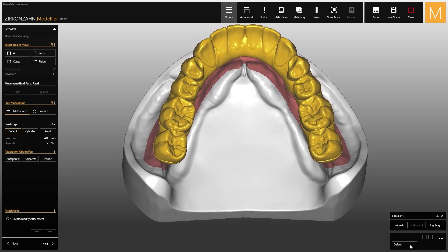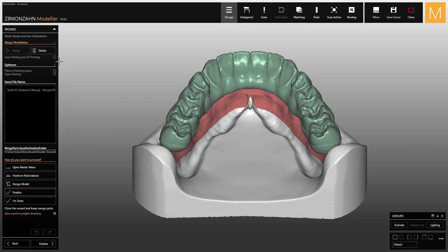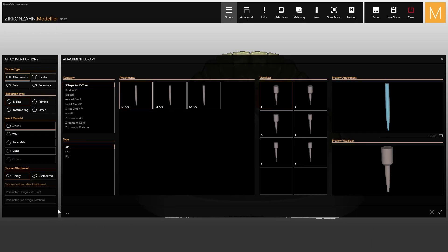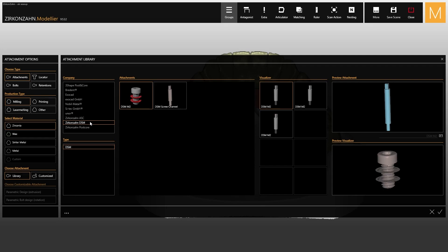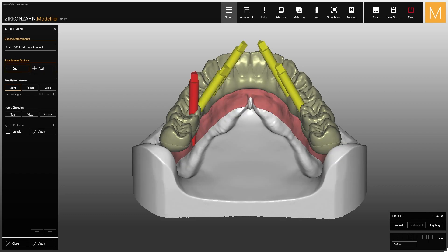As you go on, the software will adapt the wax-up to the model, and you can proceed with the design and incorporation of the secondary structure. At this point, go to the finished parts modeling function and open the attachment library once again. Within the same group, select the second type of attachment. These attachments perfectly match with the shape of the visualizers and are used to realize the same screw seat as those in the metal bar.